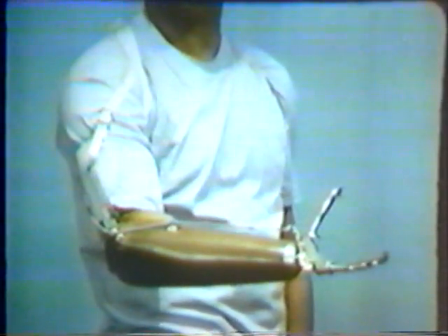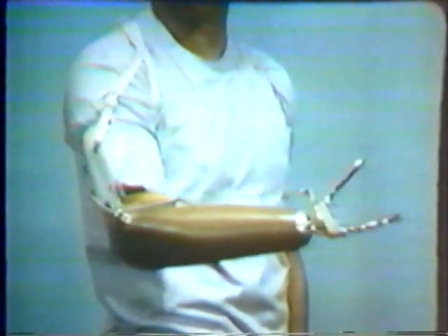Tension is exerted on the control cable, opening the terminal device. Returning the shoulder to the starting position relaxes the tension on the cable, allowing the rubber bands to close the fingers of the terminal device.